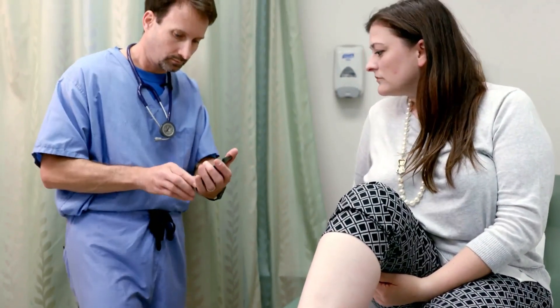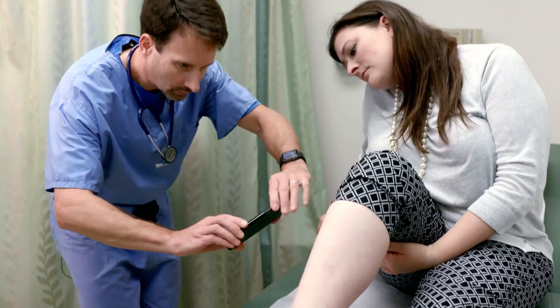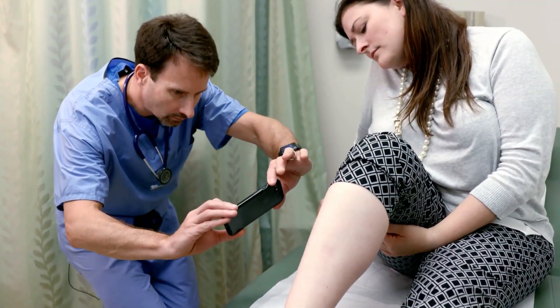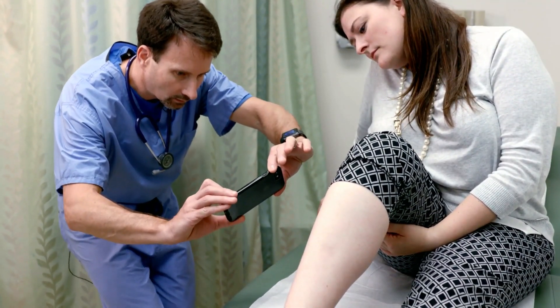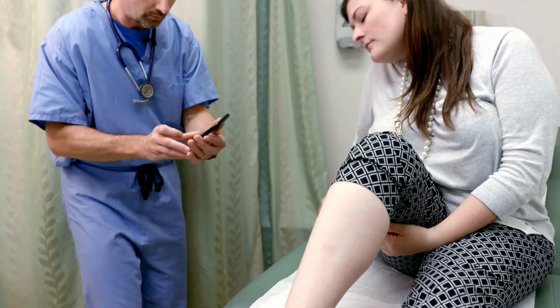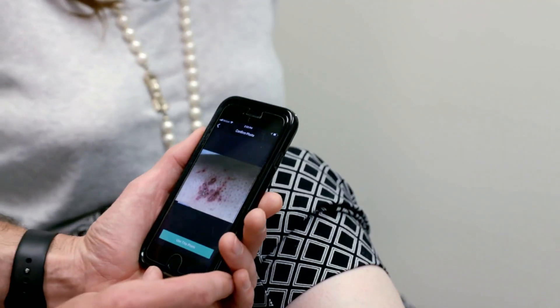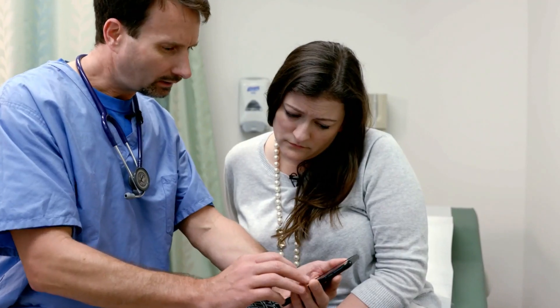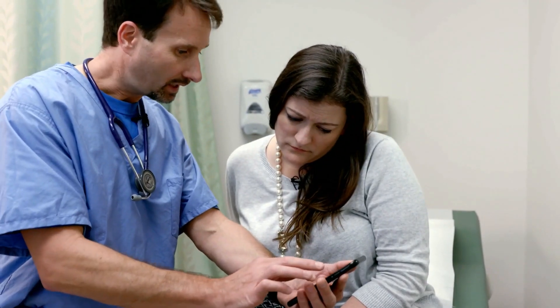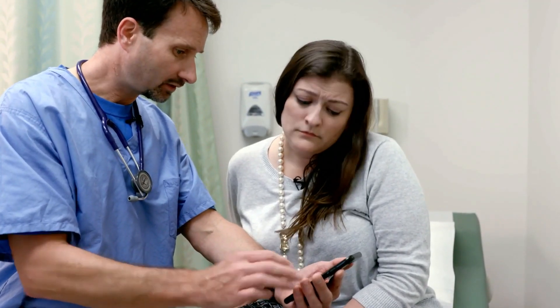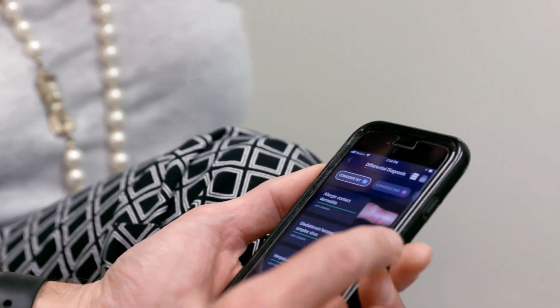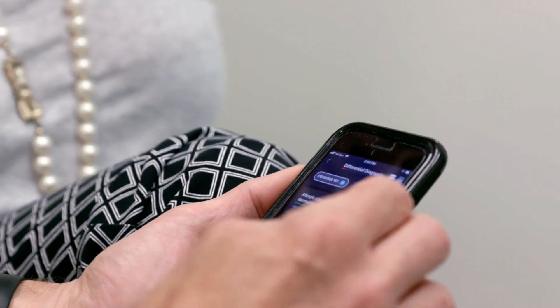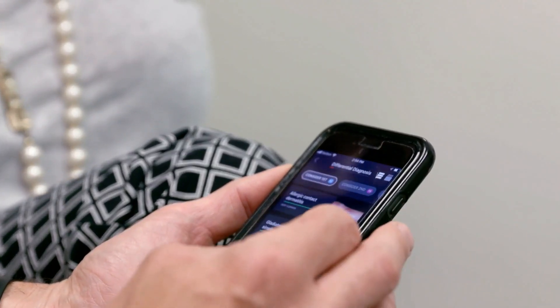Welcome to VisualDx Plus DermExpert — improving clinical decision-making one picture at a time. With DermExpert, you can take a picture of your patient's skin complaint and quickly get to an appropriate differential.